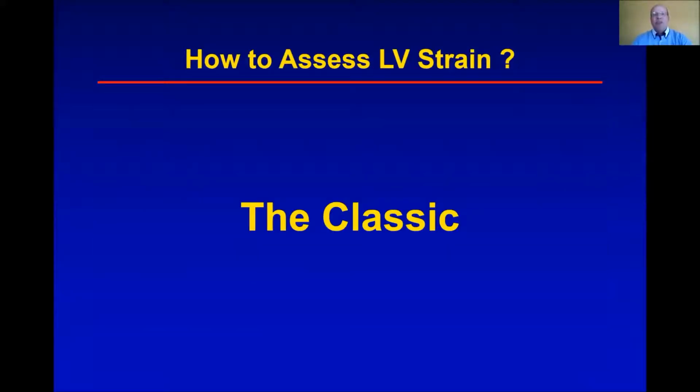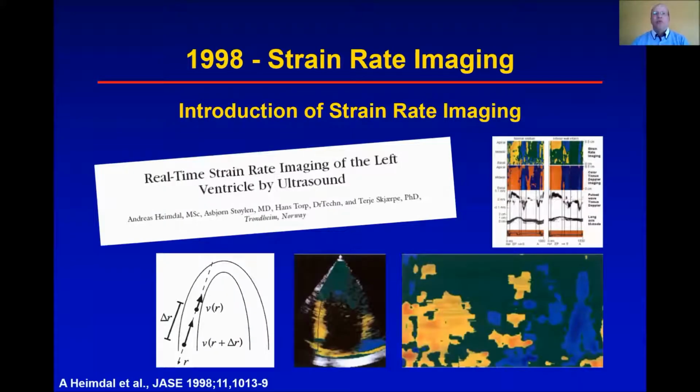So let me start with the content. We are talking about strain and about the assessment of myocardial function, and we have different ways of doing that. And the classic way was introduced in 1998. This is quite a while ago, 22 years, when the first publication was launched about the use of tissue Doppler based strain assessment of the left ventricle.